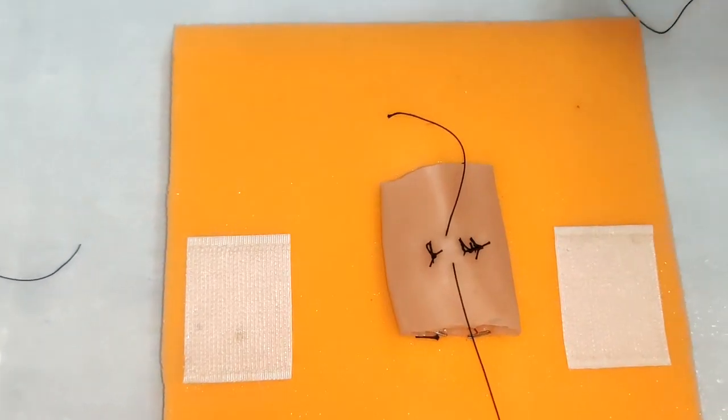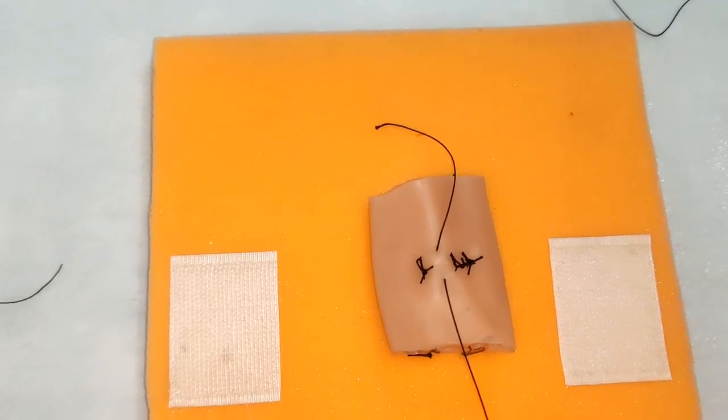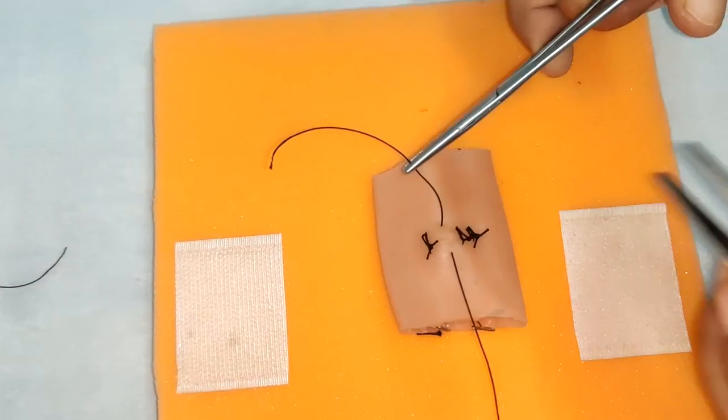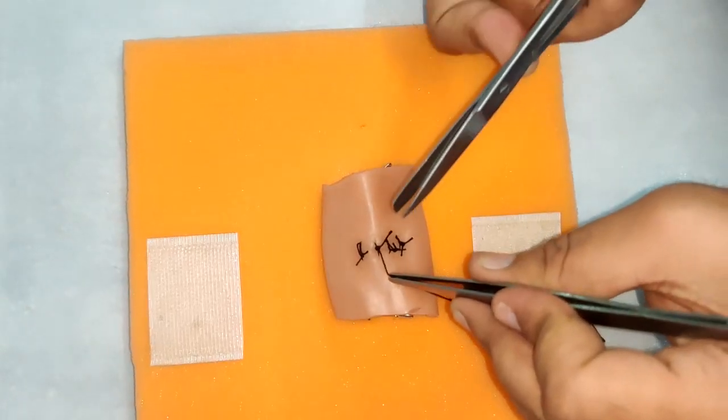We will repeat the same step for the final suture. So this is how it should look.